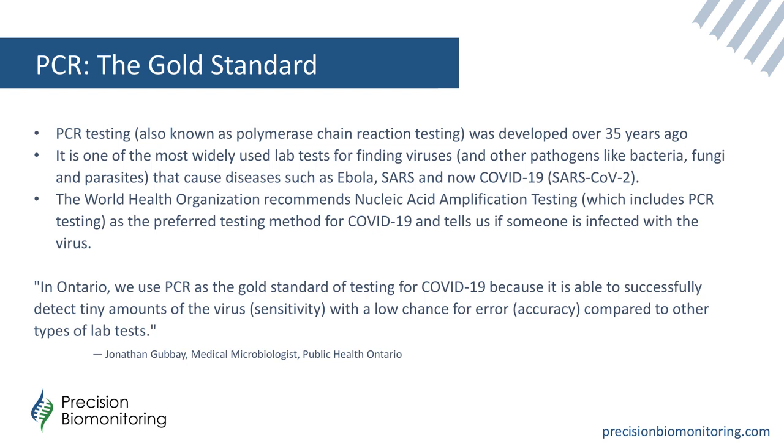So this quote from Public Health Ontario just notes that in Ontario, PCR is the gold standard for testing for COVID-19 because it's able to successfully identify small amounts of the virus with a low chance of error compared to other lab tests.